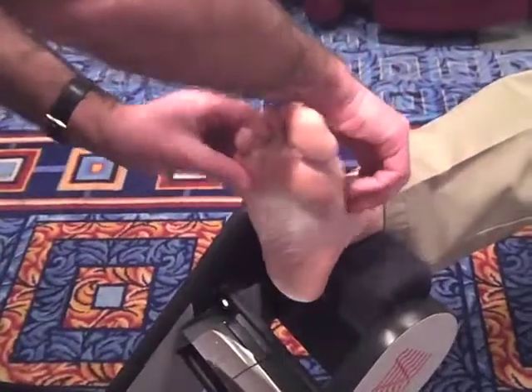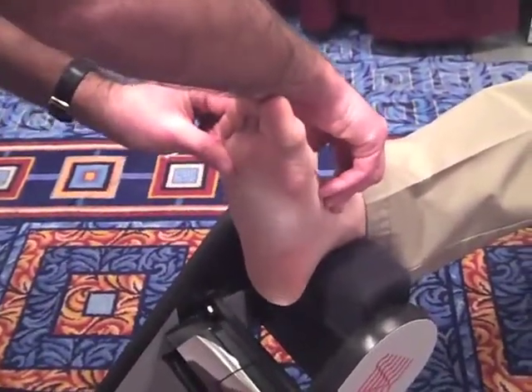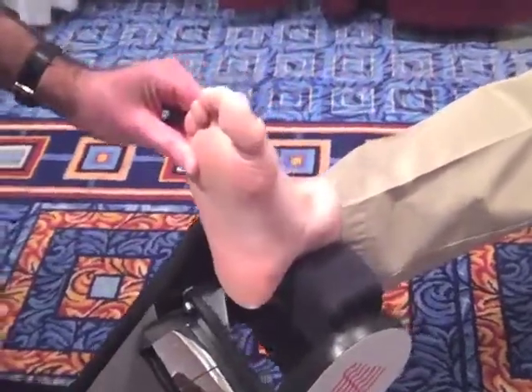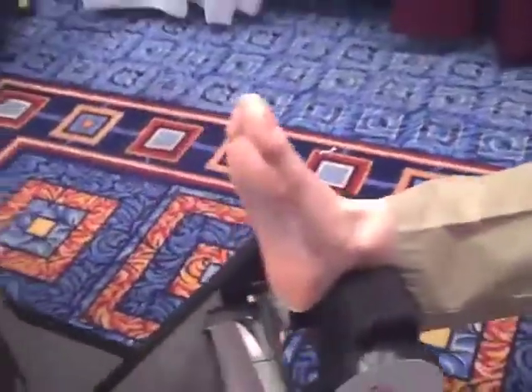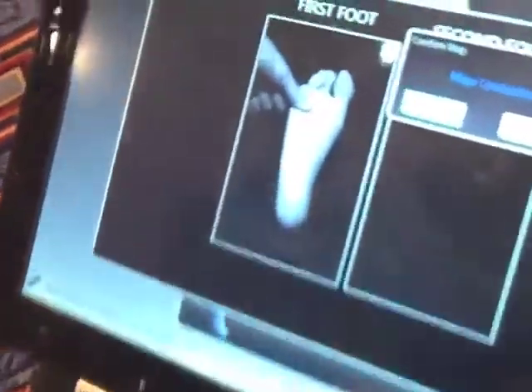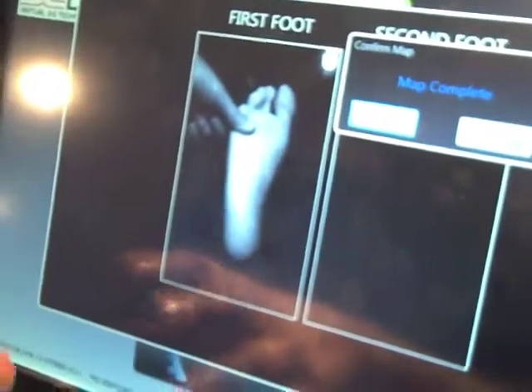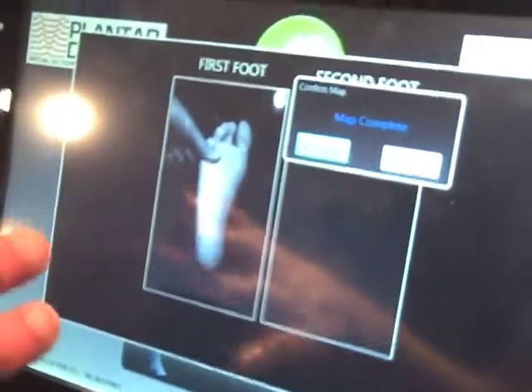I prefer to get an off weight bearing, subtalar neutral position, and we lock the lateral column. That flash is how long it takes to do the actual digital mapping of the foot — it's stroboscopic. We stop motion with this system. This is not a scanning system; this captures the foot instantaneously in one image.